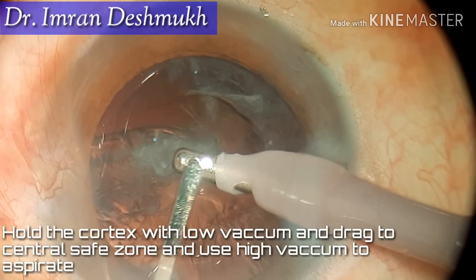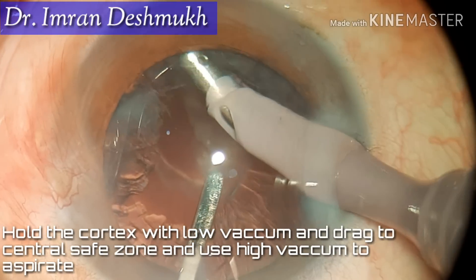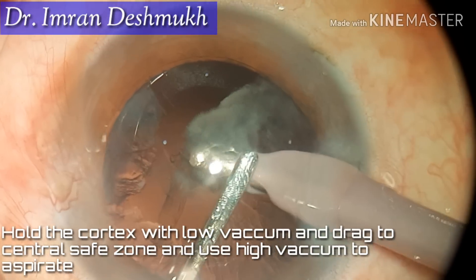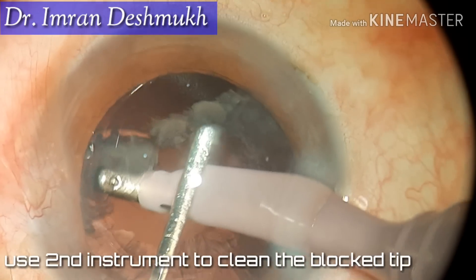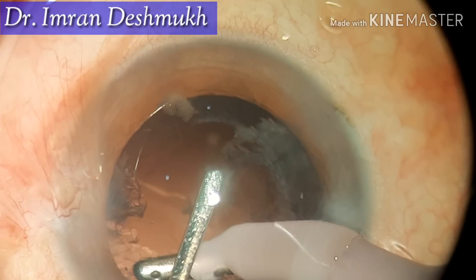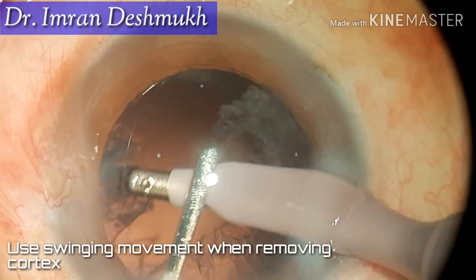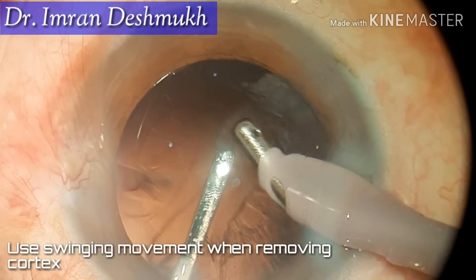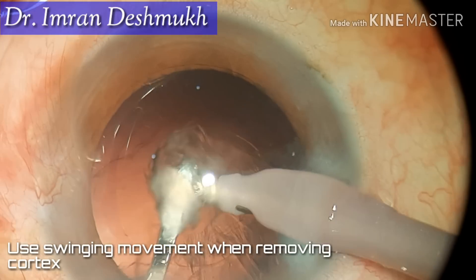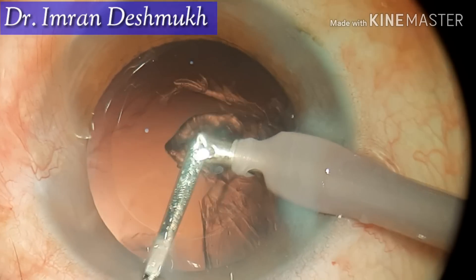While removing the cortex, hold the cortex from the periphery with low vacuum, drag it to the central safe zone, and use high vacuum for aspiration. You can use the second instrument for cleaning a blocked tip. Always use a swinging motion while removing the cortex — a large chunk of cortex can be removed by this technique. Slowly hold with low vacuum, swing the cortex, bring it to the center, and use high vacuum for aspiration.